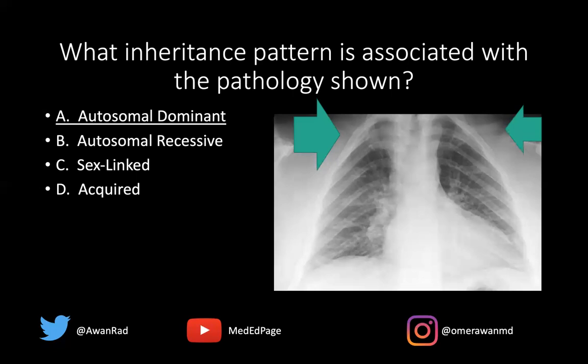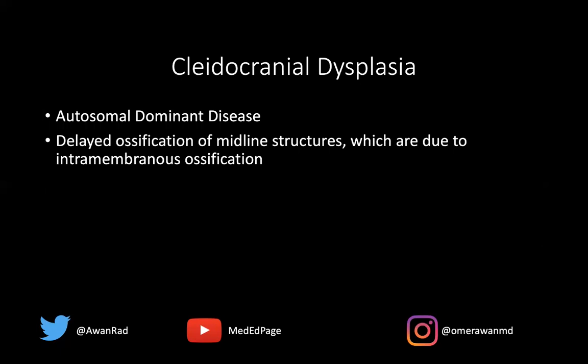Sometimes it's hard to recognize something that should be there that's not there. That can often be very problematic when we're talking about identifying pathology. This is a really nice case of cleidocranial dysplasia — again, it's an autosomal dominant disease. This represents delayed ossification of midline structures; the clavicle is a midline structure, often due to intramembranous ossification.